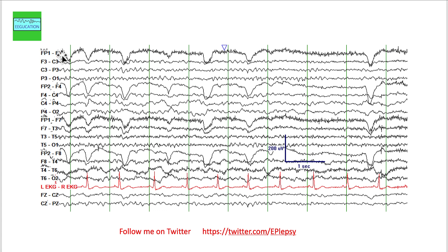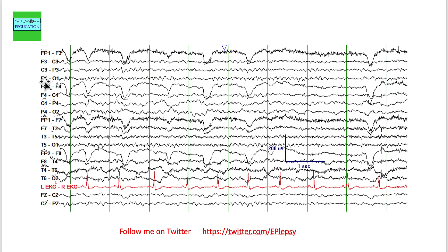Channels such as FP1-F3 or F3-C3 are individual channels. Channels ending with an odd number record from the left side of the brain; channels ending with an even number record from the right side. The letters indicate location: FP is frontopolar, F is frontal, C is central, P is parietal, O is occipital. For example, P3O1 records from the left parietal-occipital region, while P4O2 records from the right parietal region.